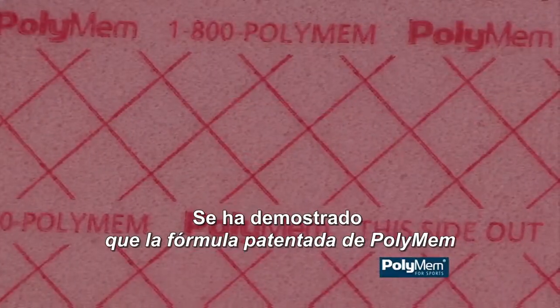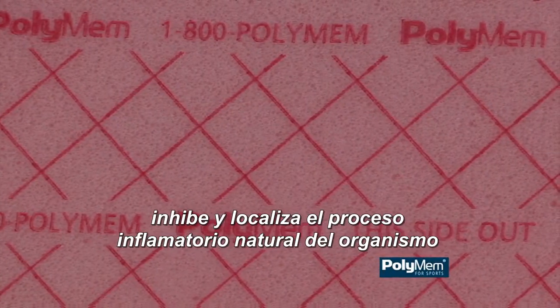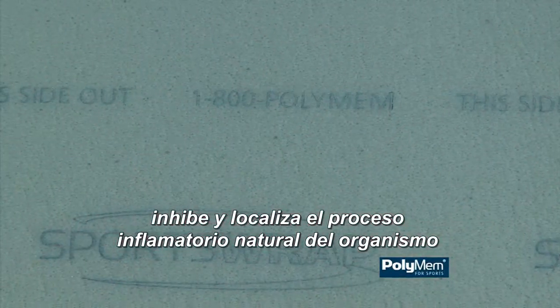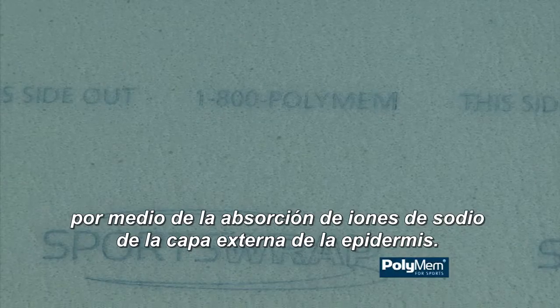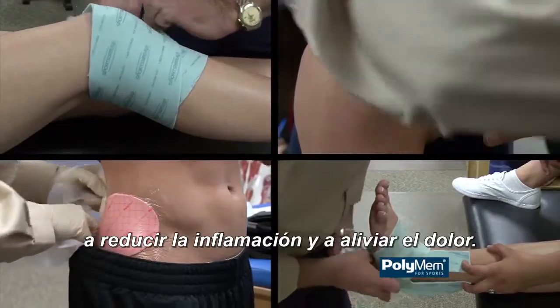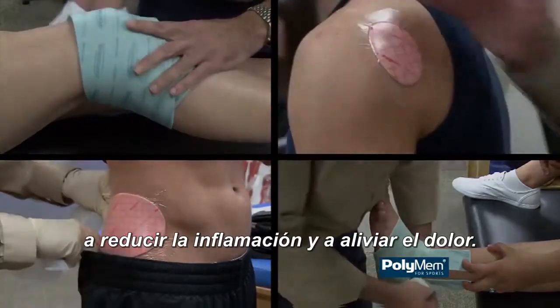PolyMem's patented quadrofoam formulation has been proven to inhibit and localize the body's natural inflammatory process through the absorption of sodium ions from the outer epidermis. PolyMem can help reduce inflammation and relieve pain in the process.